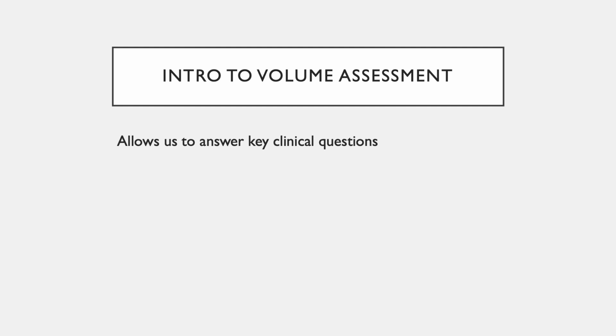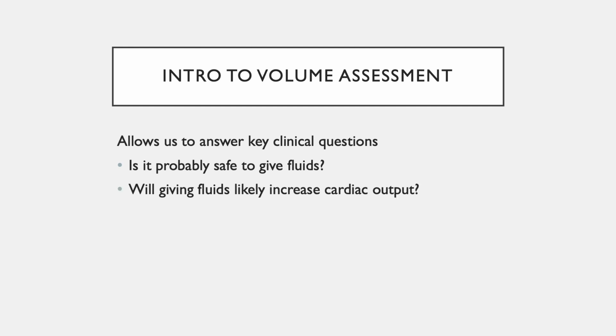A comprehensive volume assessment will allow us to answer key clinical questions that will influence our management of patients. The first question we want to answer is, will it be safe to administer fluids? While this may seem intuitive, IV fluids are administered every day without really considering this question. Of course, giving any intervention without ensuring it is safe to do so would defeat the purpose of what we aim to do as physicians.